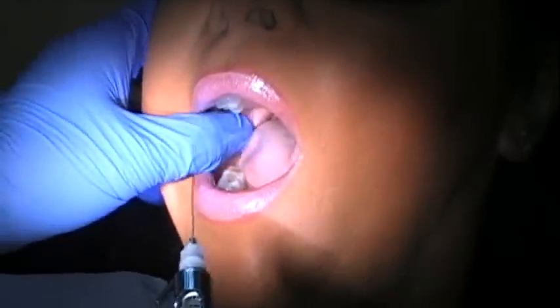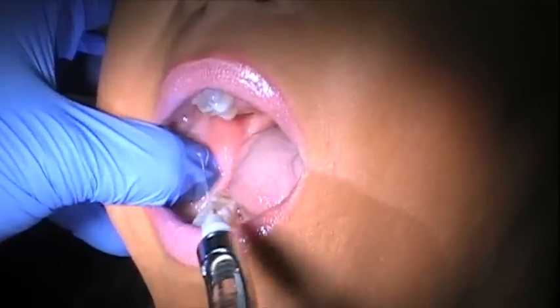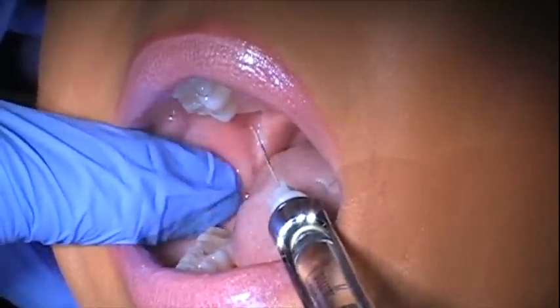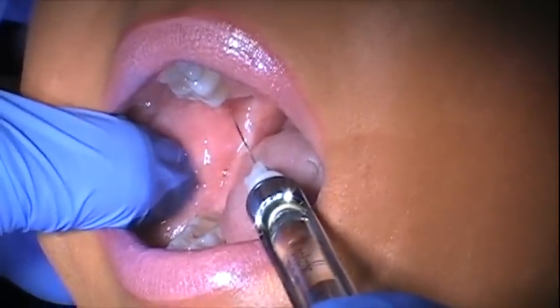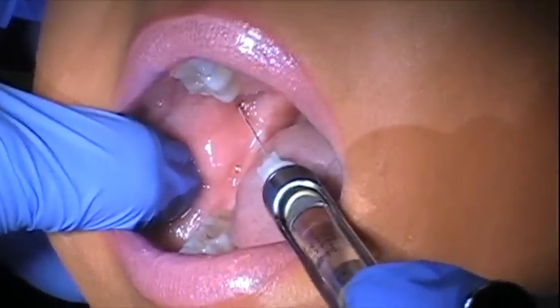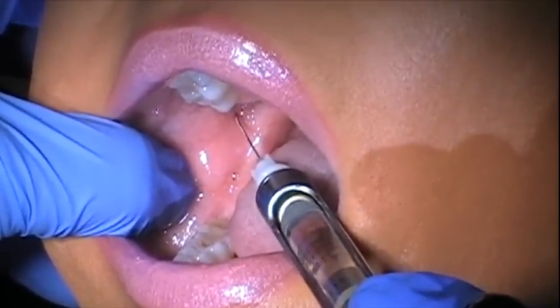My thumb is resting on the coronoid notch and my middle finger is in the intertragic notch — that gives me my line. The barrel is over the premolars. I'm at the height of the mesiolingual cusp of the second molar, just distal to it. I penetrate and aspirate — it's negative — so I'm going to give a few comfort drops.